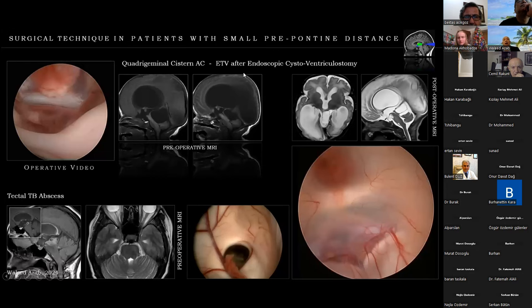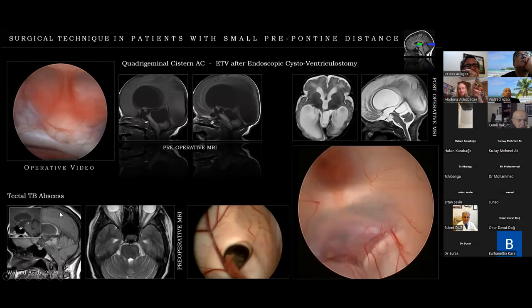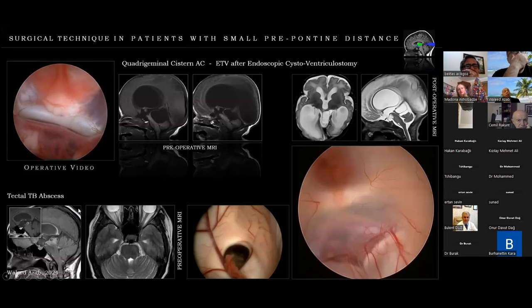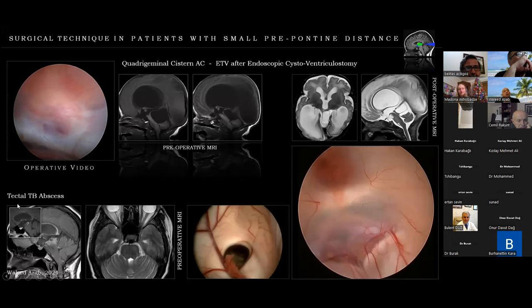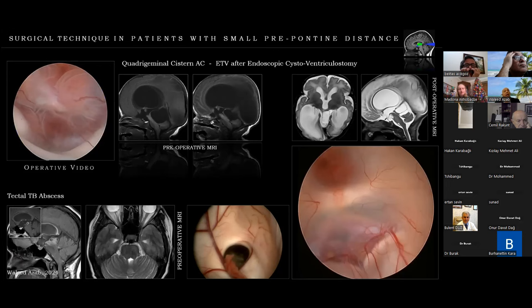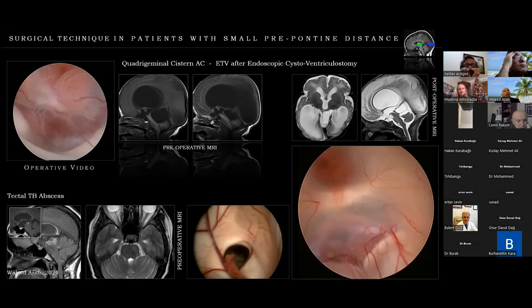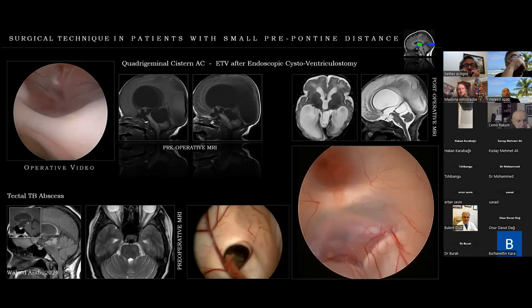Here is an example in a very young child with a quadrigeminal cistern arachnoid cyst. An ETV was done after endoscopic cyst fenestration. The pituitary gland, anterior lobes, posterior lobe, and dorsum sellae are visible, with the tip of the basilar branches seen. There is no space for a standard ETV. A bipolar probe is used mechanically to apply pressure against the bone or cartilage of the dorsum sellae. The Dex forceps opens the membrane, and with the change of pressure differential, the membrane starts to undulate. The Fogarty catheter is then used to inflate the balloon and achieve the stoma.